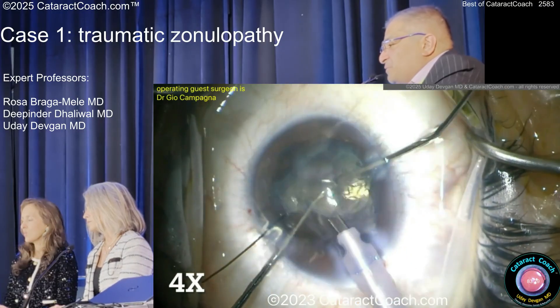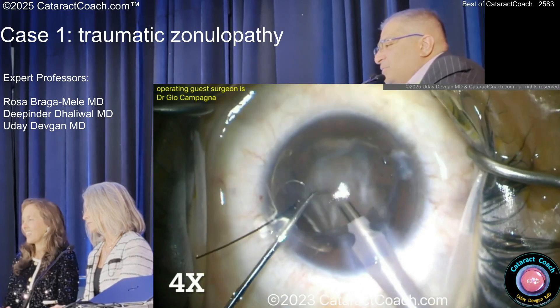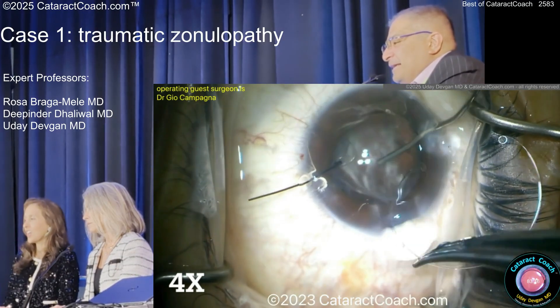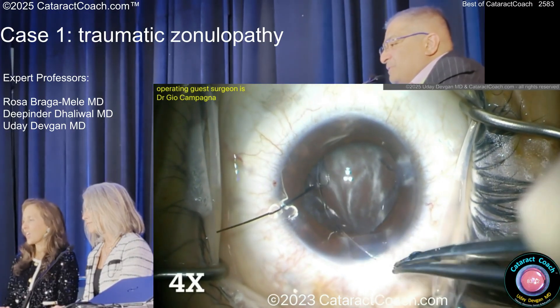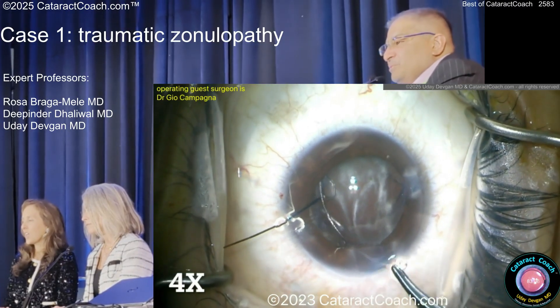Nucleus removal is easy, especially if you use a special three-handed technique. But now, what's going on back there? Why does it still look whitish? Any guesses? That's called way too much triamcinolone at the beginning of the case. If there's so much triamcinolone, you didn't dilute it enough — now you've got triamcinolone in the anterior hyaloid space and the red reflex is kind of crummy. So that's called too much triamcinolone. I dilute the triamcinolone about 10 milligrams per cc.